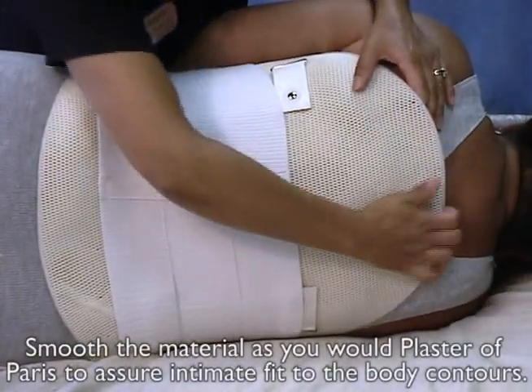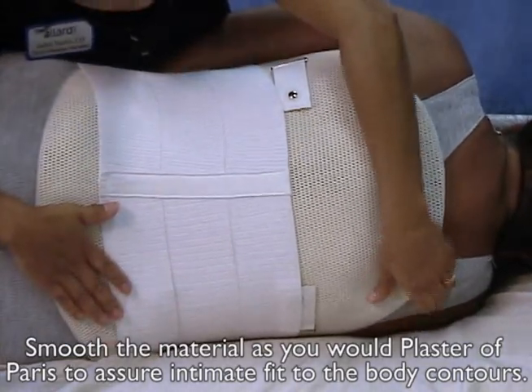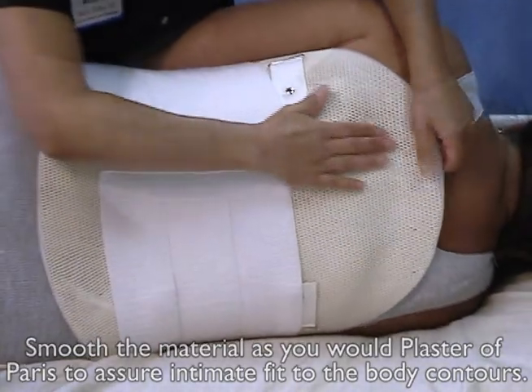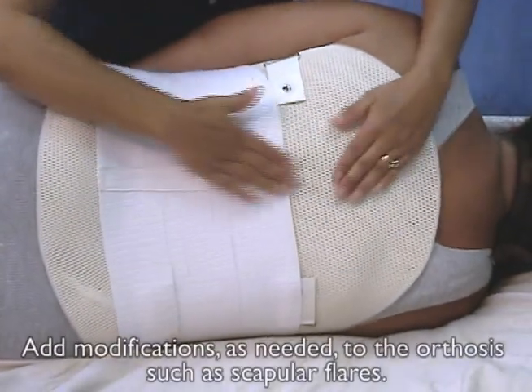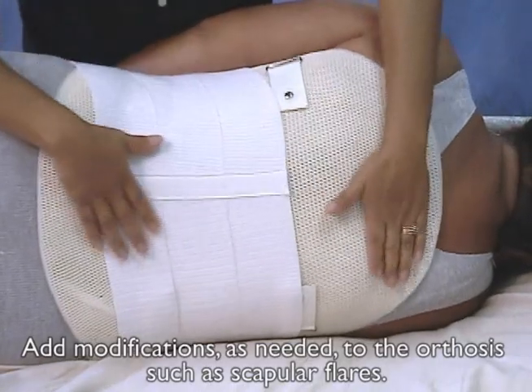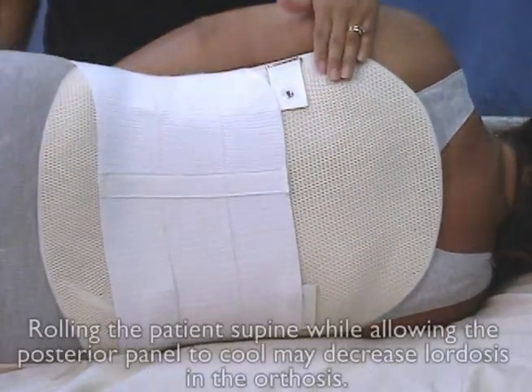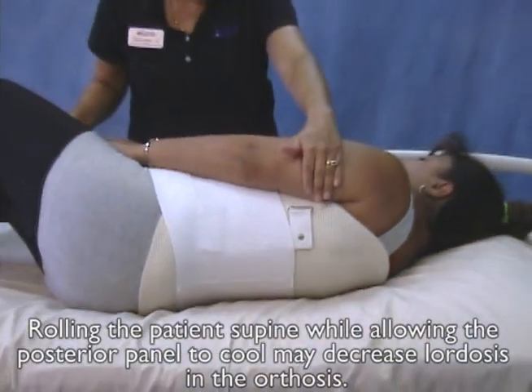Use the hospital binder to help with orthosis placement. Smooth the material as you would plaster of Paris to assure intimate fitment to the body contours. Add modifications as needed to the orthosis, such as scapular flares.